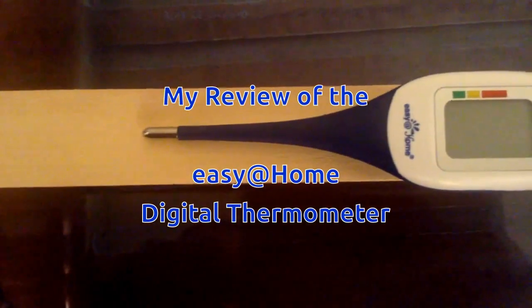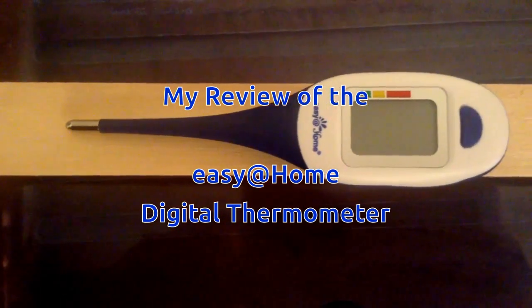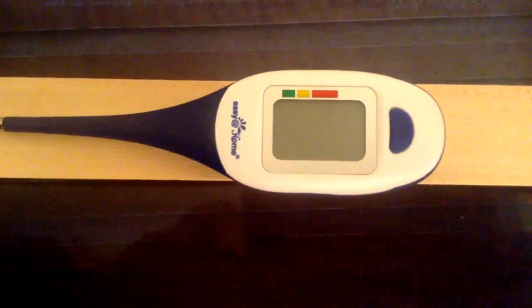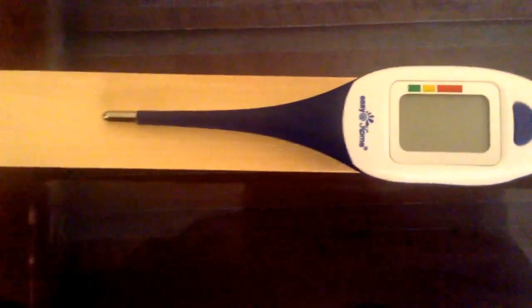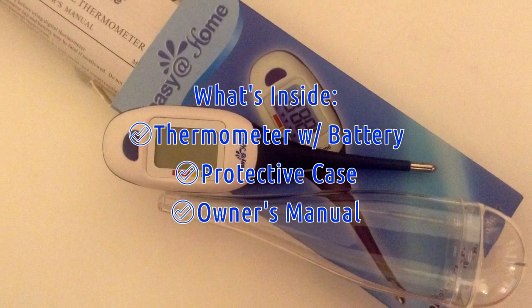The Easy At Home Digital Thermometer is a great and comfortable tool to measure body temperature. It is very simple to use and designed to be practical. I like the fact it has only one button to perform all functions this thermometer offers.